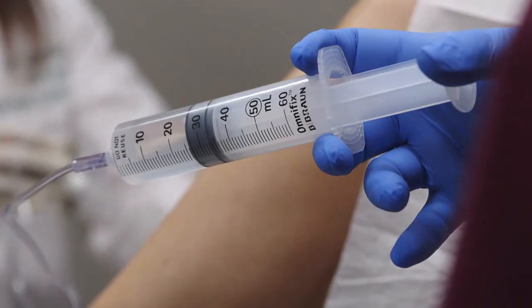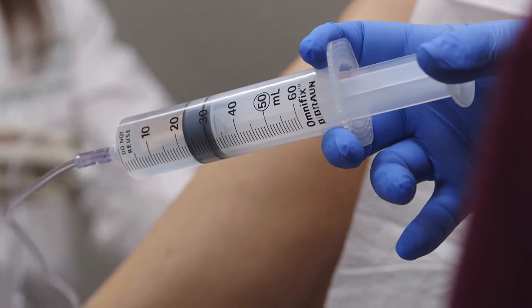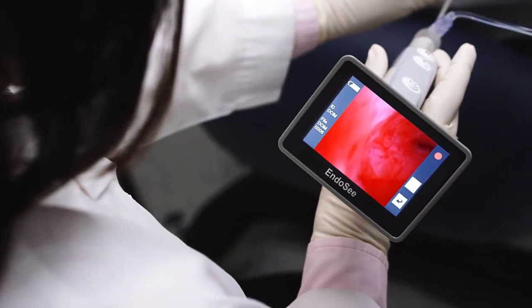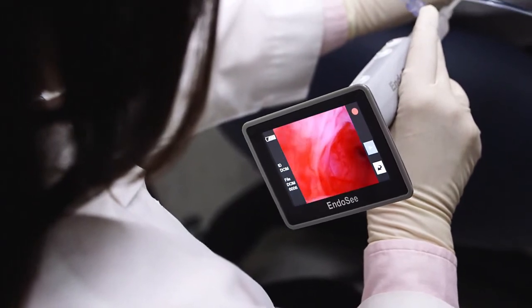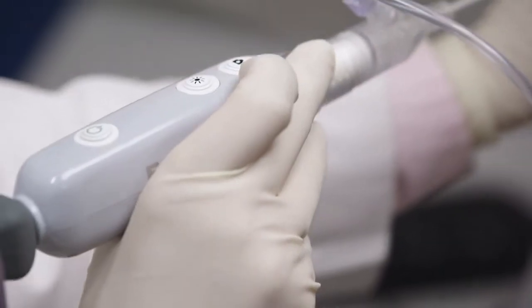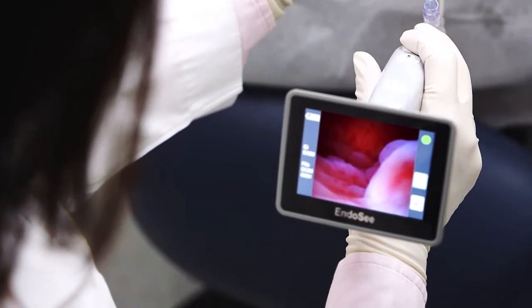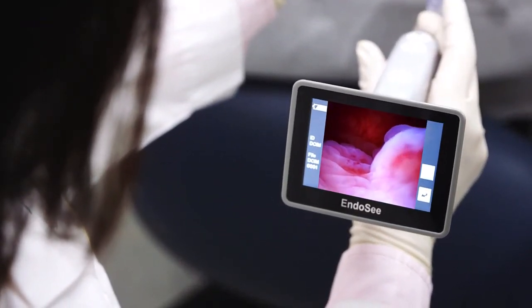Infuse saline to distend the uterus until you achieve optimal visualization. When viewing the sides of the uterine cavity, including the tubal ostia, rotate the entire device. The image on the handset always remains upright. To capture still photos during the procedure, simply press the camera button once. For video, press and hold the camera button until the green dot in the upper right-hand corner of the display changes to a red blinking dot.